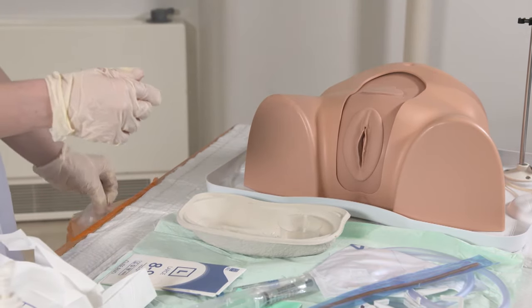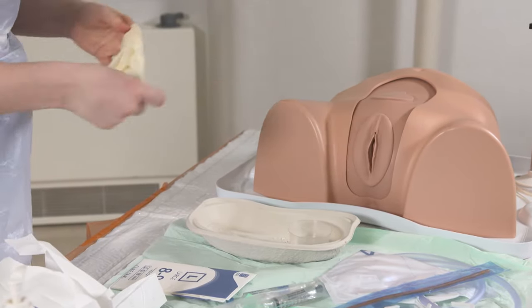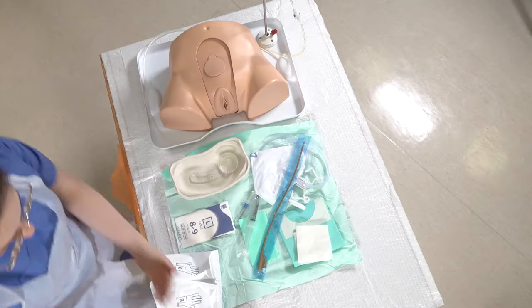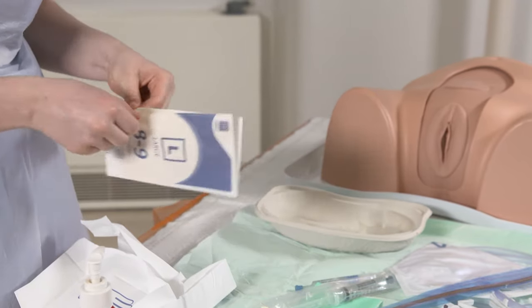So now I'm going to put that gauze in the bin and take these gloves off, wash my hands again, and then put my second set of gloves on.